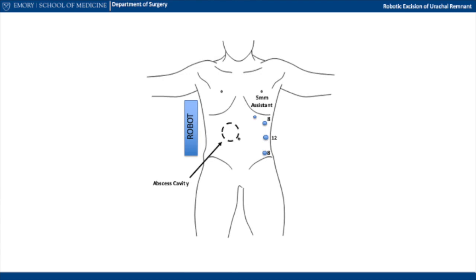Once in the operating room, a side dock was performed on the patient's right with a 12mm camera port in the left mid-abdomen and two 8mm robotic ports on either side, as well as a 5mm assistant port near Palmer's point, triangulating on the abscess cavity depicted with the hash circle on the diagram shown.